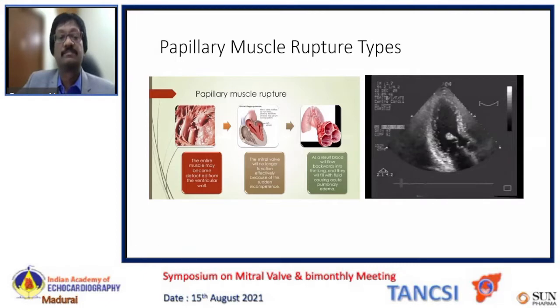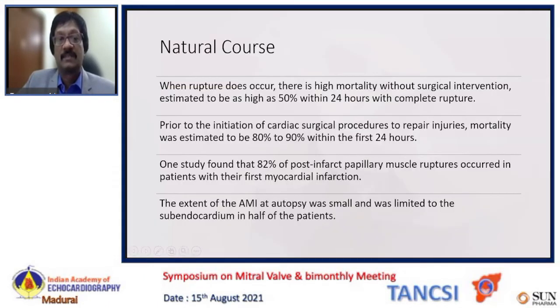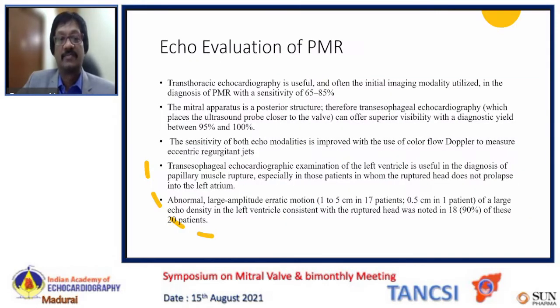I will skip some of the slides and I will finish that. The role of esophageal echo is very vital. The sensitivity of this TEE modality goes up to 100% for diagnosing papillary muscle rupture, and please utilize the transgastric view, which can easily identify the papillary muscle head being ruptured.